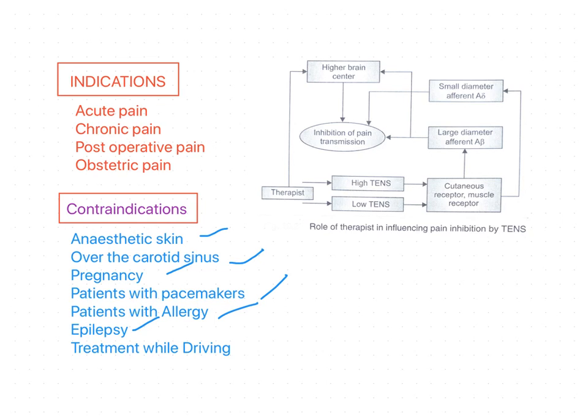That means only with the physician's suggestion can we treat epilepsy patients. Also, TENS should not be advised while driving or operating machinery. So these are the indications and contraindications of the TENS.